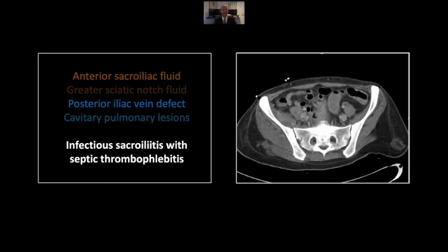Our next case is infectious sacroiliitis with associated septic thrombophlebitis. The most important finding is a semilunar hypodense fluid collection on the deep aspect of the iliacus muscle, lying just on the lateral aspect of the anterior sacroiliac joint. In my experience, that is pathognomonic for infectious sacroiliitis — that is where fluid from an infected sacroiliac joint collects. I will call that infectious sacroiliitis, as I did in this case, even without bone window findings. Also present is a filling defect in the posterior division of the internal iliac vein, consistent with septic thrombophlebitis in this setting.